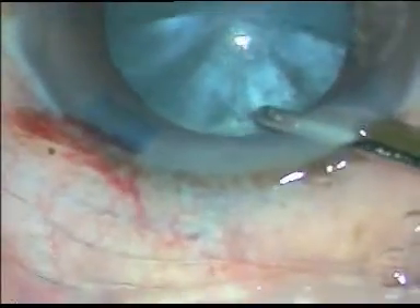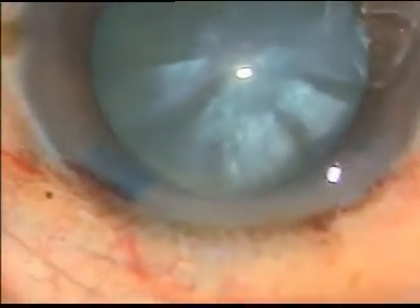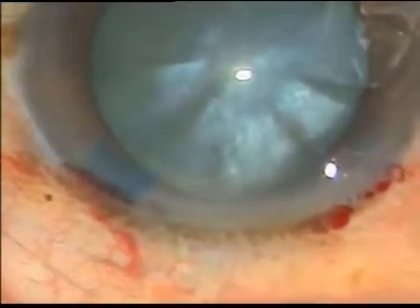Now after washing it out, I give viscoelastic substance, and then I made a side port on the right side at around 8:30 o'clock.